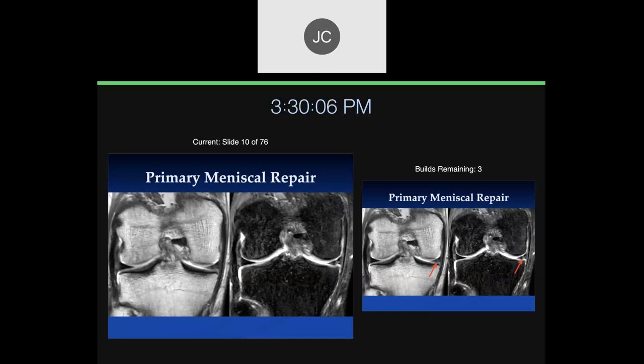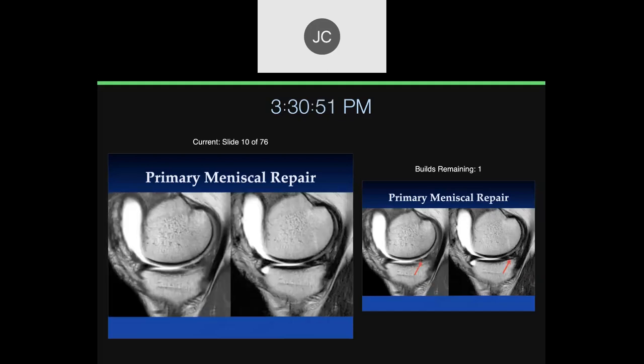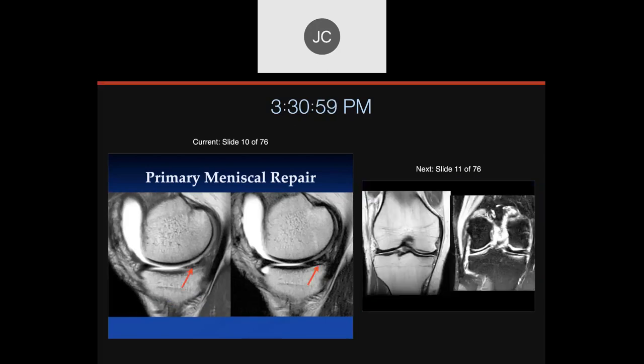Here's an example of someone who had a medial meniscal tear with a primary repair of the meniscus — which is considered optimal treatment for the right candidates. Our role is to make a diagnosis of the tear and determine whether it's best treated by no surgery, partial meniscectomy, or primary repair — MR is very helpful for that. On the T2-weighted image it's not very bright, a little brighter on the proton density fat-suppressed image. This is a good repair. You can get persistent signal intensity in areas of scar tissue in the repair process.